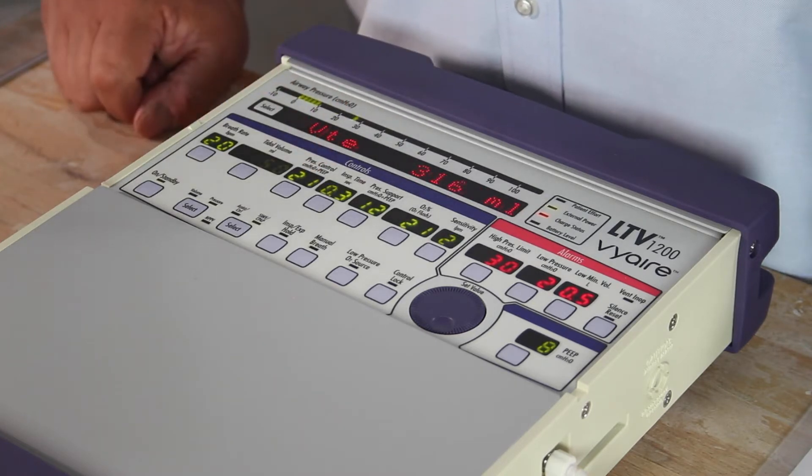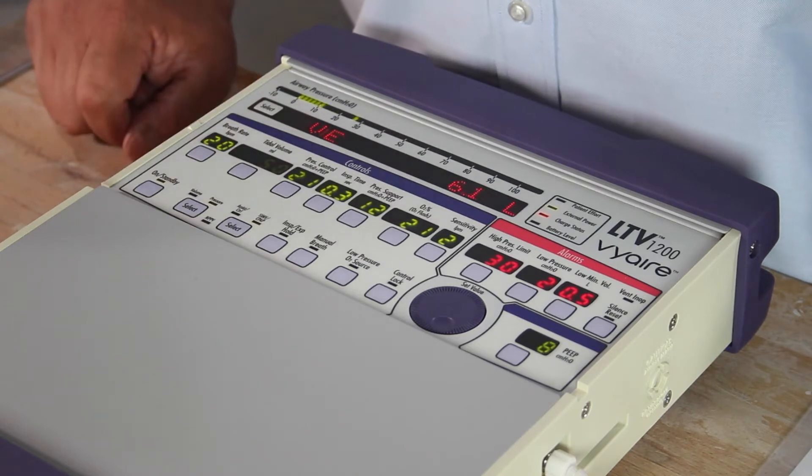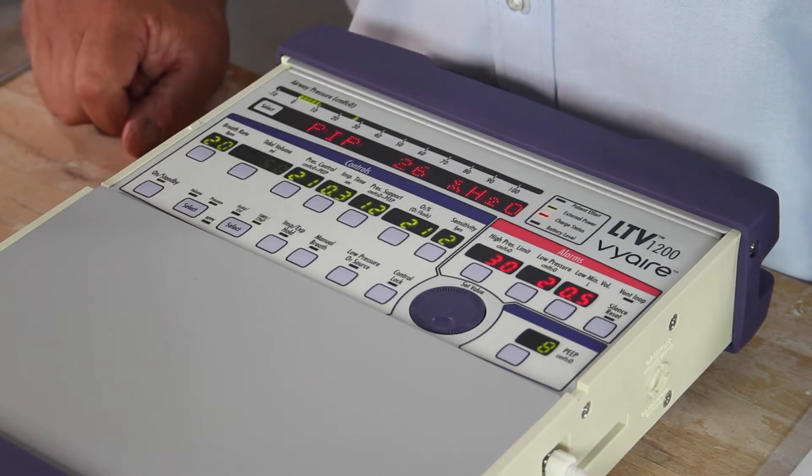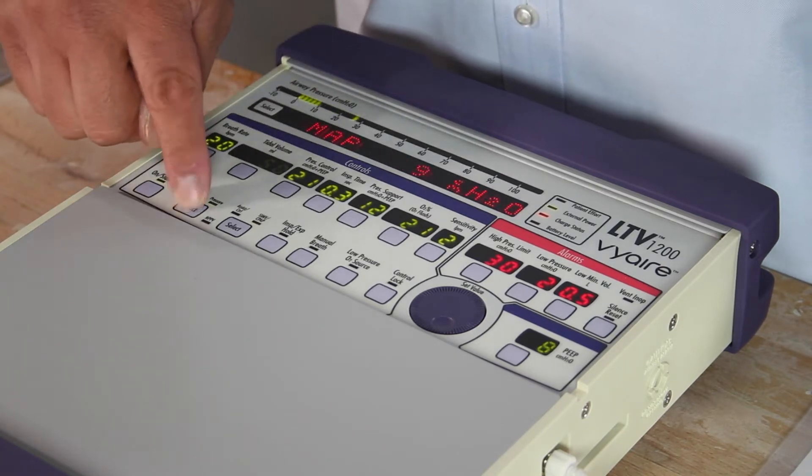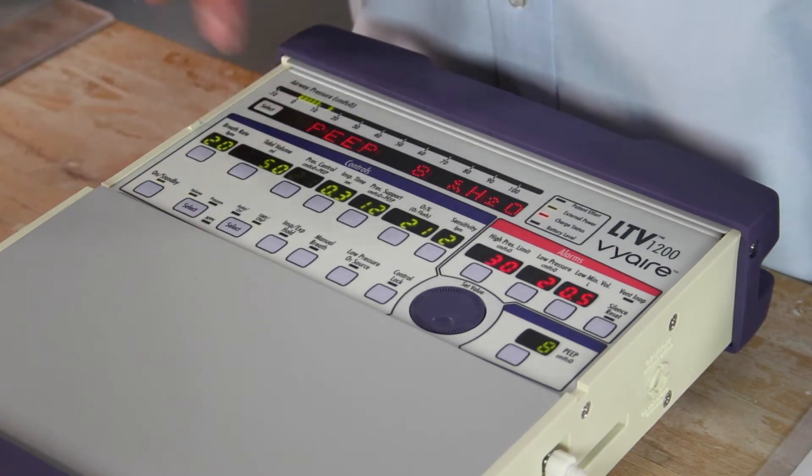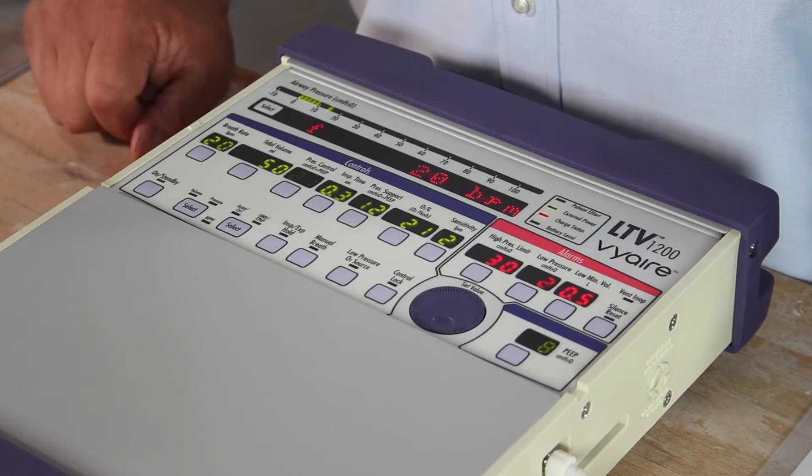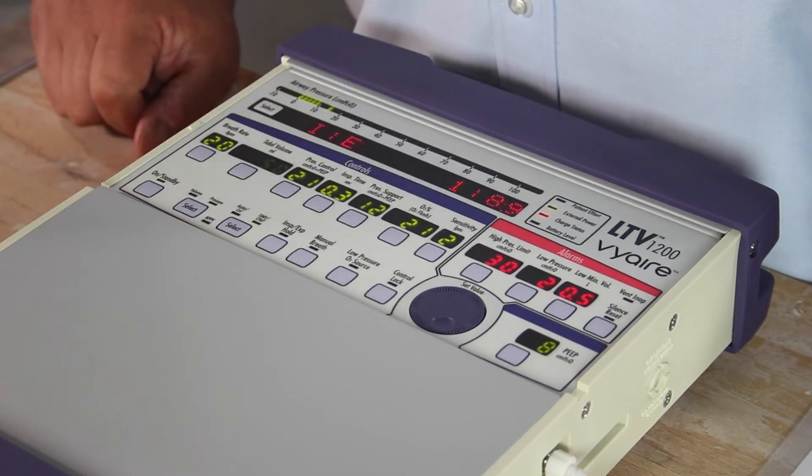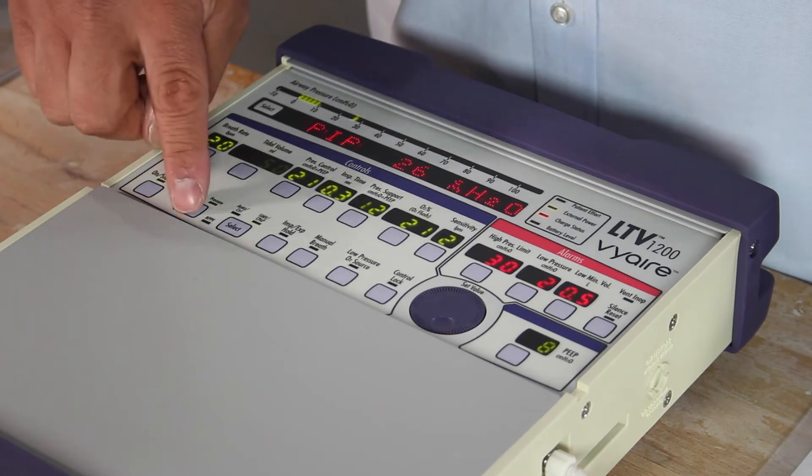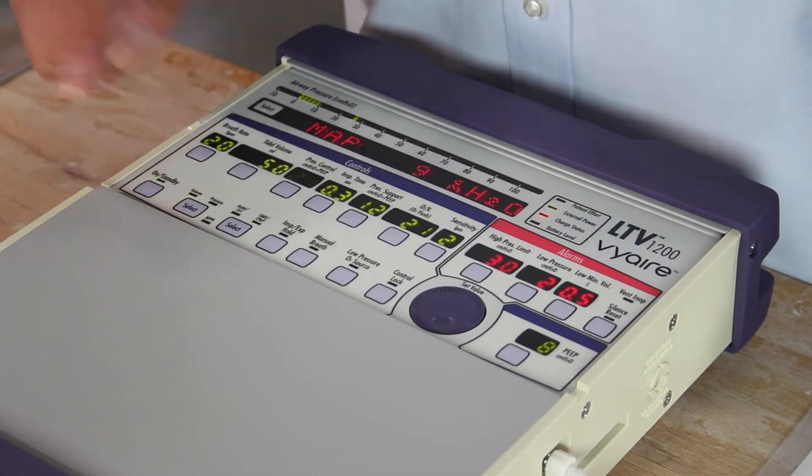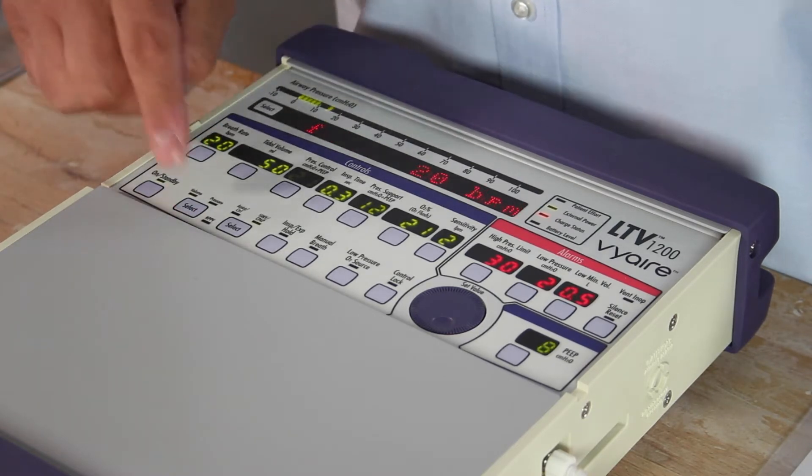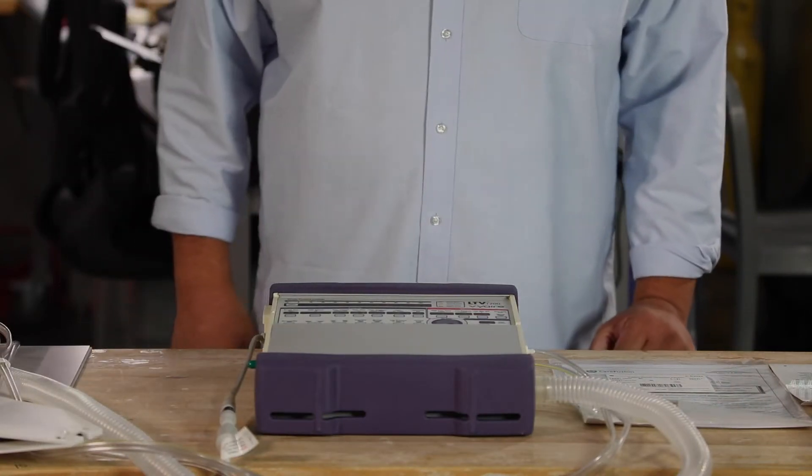I'm going to switch from pressure to volume. Simply press once. It's blinking volume. I have to press twice, one more time to confirm. And we are now in volume. Press again, pressure is blinking. I press one more time and we're back in pressure control. Let's do that again. Press once, press again to confirm. I am now in volume ventilation. Switch back to pressure, press once, confirm. I am now back in pressure control.